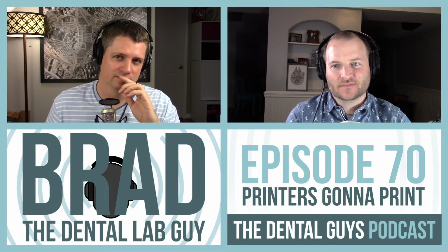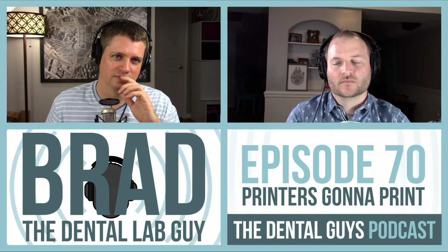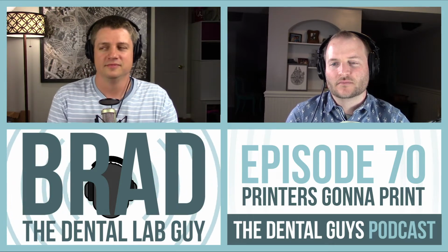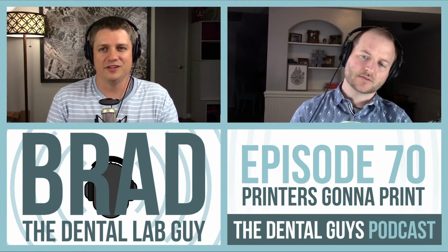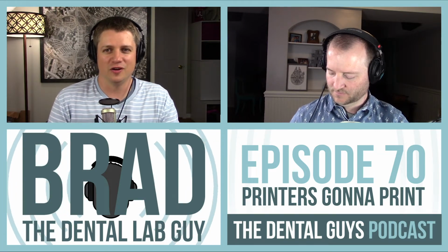I don't know if I'd totally say that we validate our milling, because I trust my milling much more. That strategy's been around for a long time. Don't get me wrong, I wouldn't say I'm proving my printers are good. I'm more or less saying that my crowns and my models match the accuracy of my printing. So basically, I like what you said there, though. Milling's been around a lot longer.